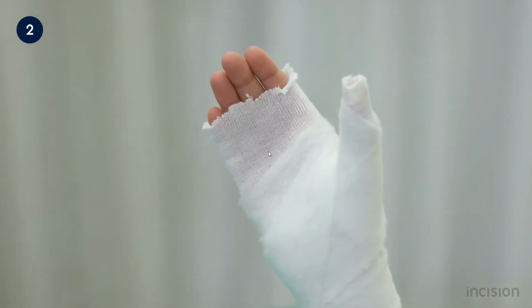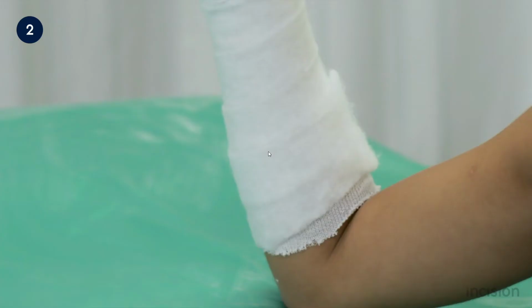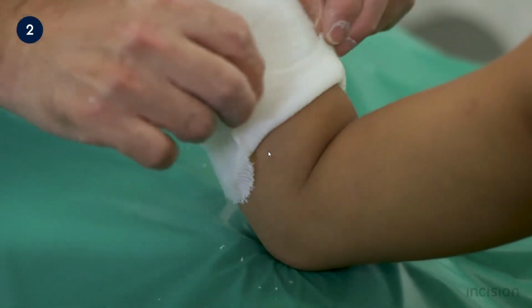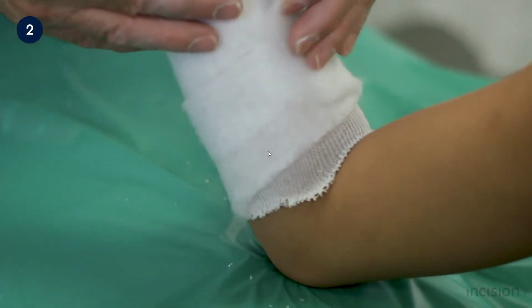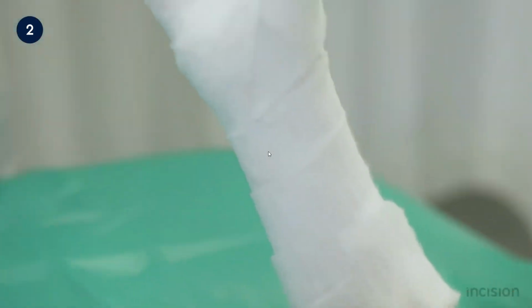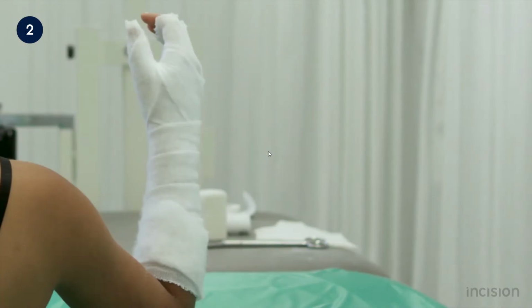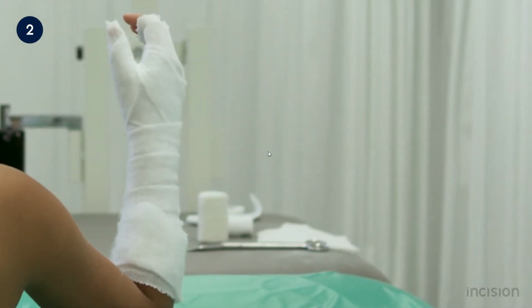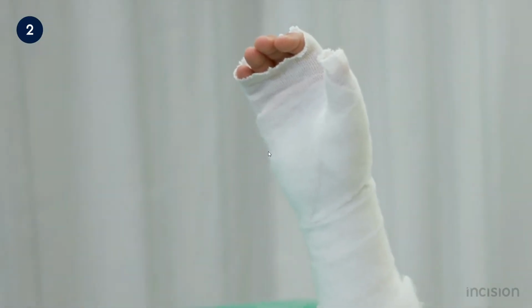After applying the padding, the stockinette is still exposed distally and proximally. This way it can be folded back, as shown here, to protect the skin from sharp edges after the splint is applied. It is advised to check that there are no uncovered areas left. This should be avoided to limit the risk of thermal injury of the skin.